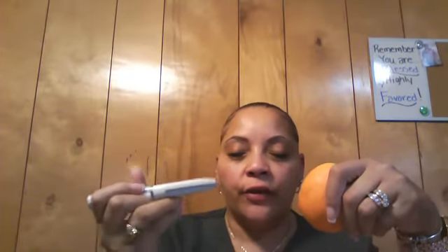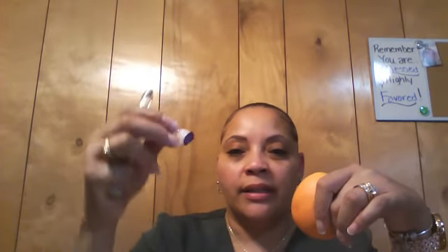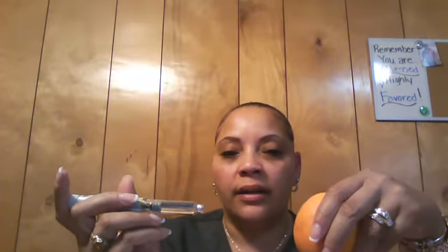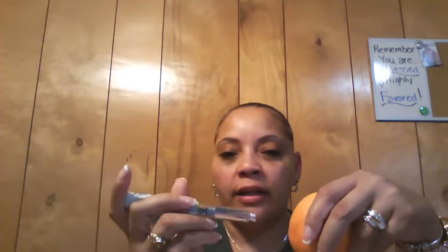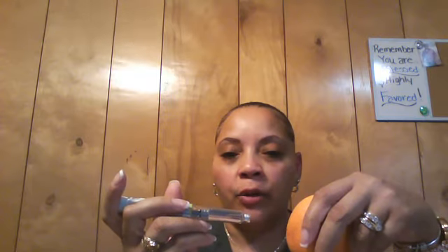I'm going to take my pre-filled syringe, and it has the needle attached, which will be this. It's attached. I'm going to go in. I'm pinching the skin up where there's adequate fat, and I'm going to go straight in at a 90-degree angle, letting him know when I'm going to do it.